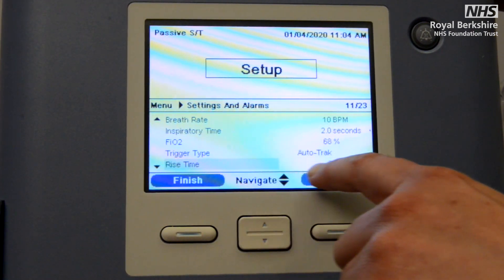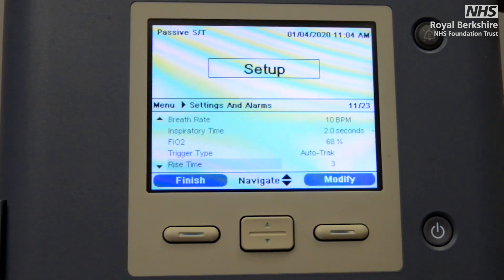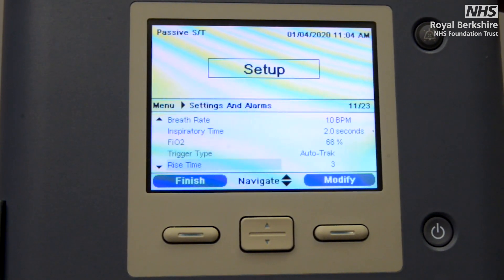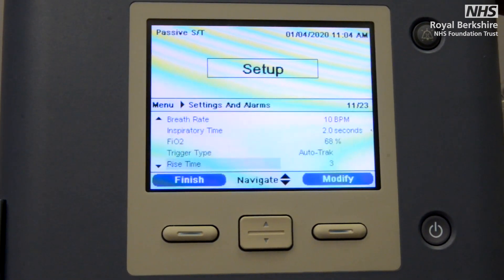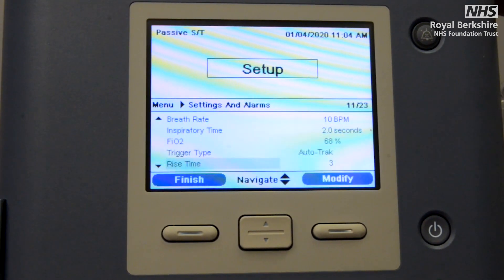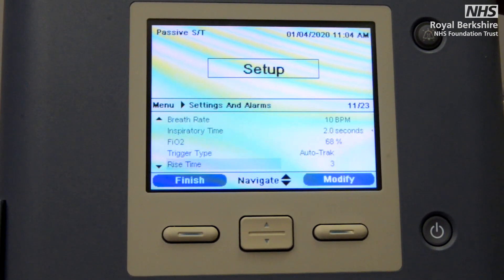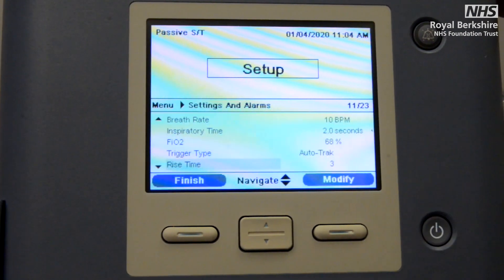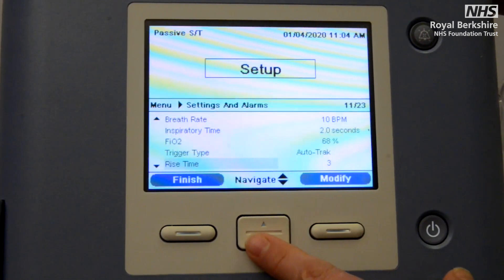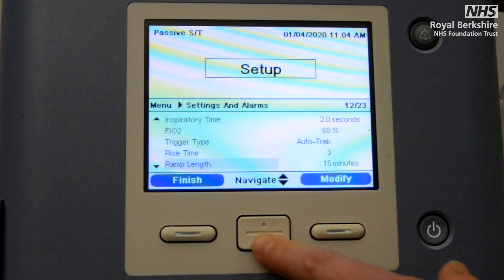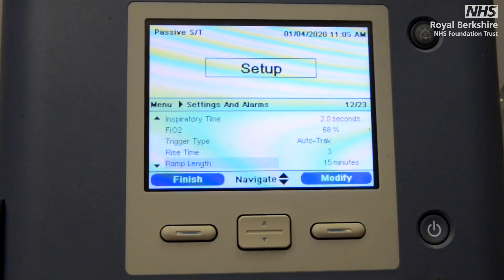Next is the rise time — please don't worry too much about this. It's a setting that can be set from one to six, so when you're initially setting up, just set it on number three, right in the middle. This relates to whether your patient is not quite achieving the inspired peak airway pressure you've set — some specialist clinicians will come and titrate that to help the machine assist the patient in achieving those settings. Set it on three for initial setup.